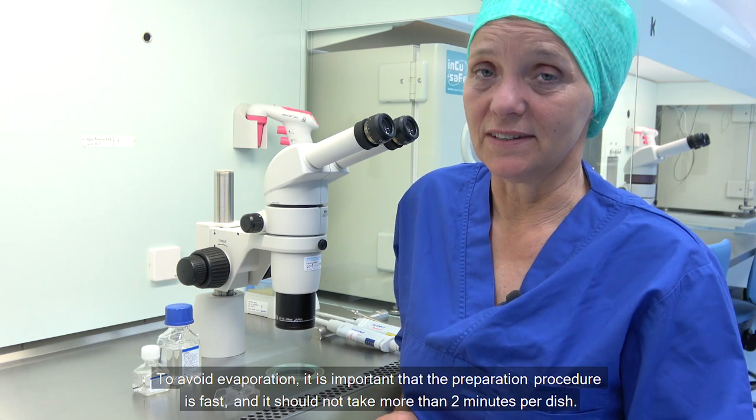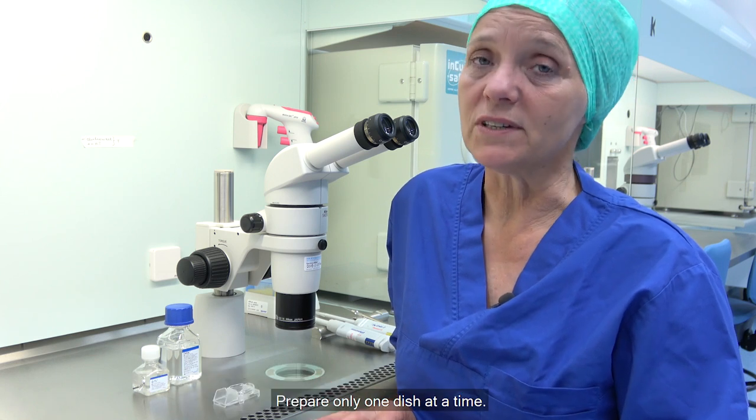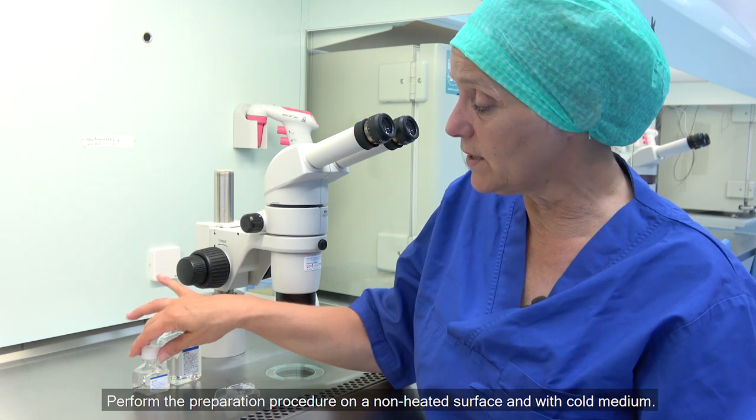To avoid evaporation, it is important that the preparation procedure is fast and does not take more than two minutes per dish. Prepare only one dish at a time. Perform the preparation procedure on an unheated surface and with cold medium.